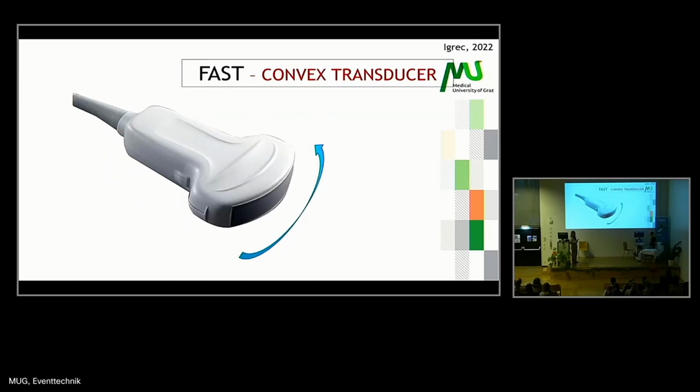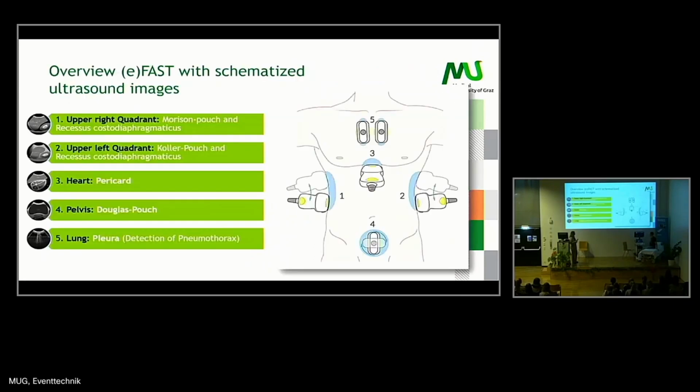So sector or linear transducers are not allowing such deeply located fluid to be seen. Overview with schematized ultrasound images. So we are doing this thing here.